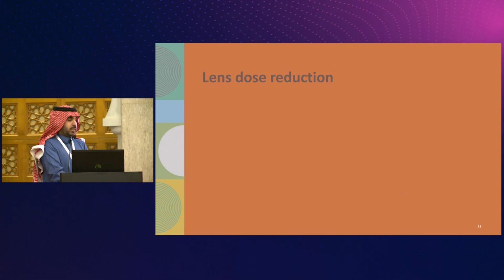Does anyone have any idea how to reduce the lens dose? You're practicing. You have patients every day. Give me your experience. Okay. We are talking about CT because the dose in CT is quite high. Yes. Angle. Okay, tilting. That's good. A prone position. Okay. Okay, patient positioning. That's good.